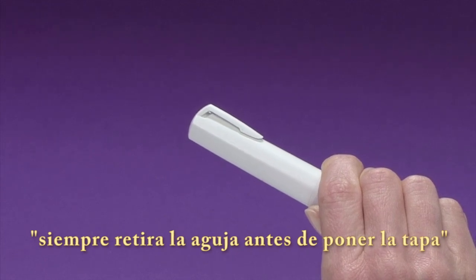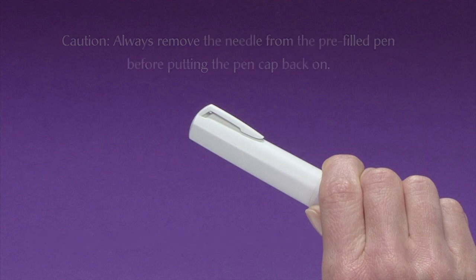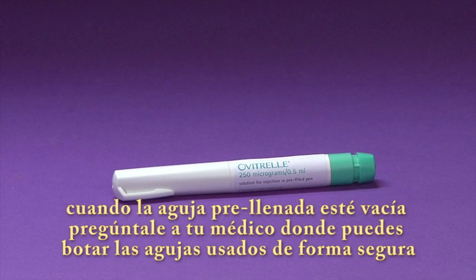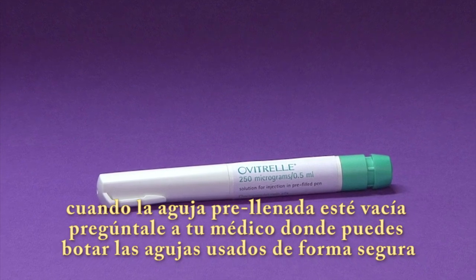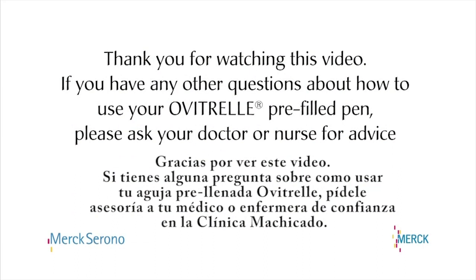Caution: Always remove the needle from the pre-filled pen before putting the pen cap back on. The pen cap cannot fit over the pre-filled pen with a needle still attached. Never store the pen with the needle still attached. When the pen is empty, ask your healthcare provider how best to dispose of medicines and needles that are no longer required.